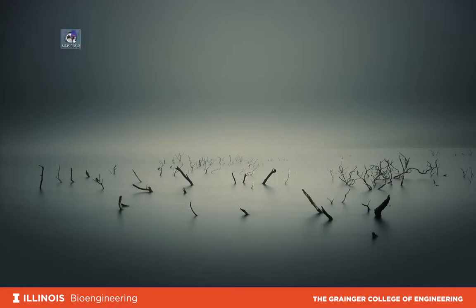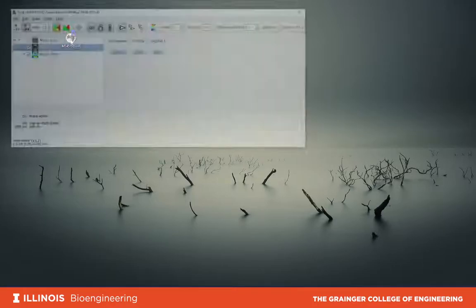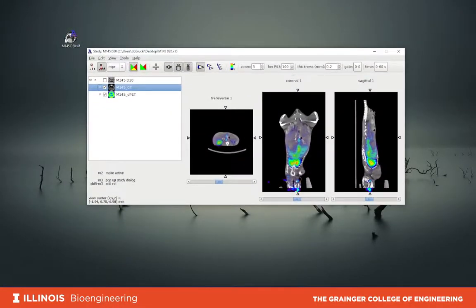This is one of the files being used for the homework. It's a dynamic dataset of nanoparticles injected into a mouse for the duration of 60 minutes. We reconstructed the images every minute, so we have 60 images at one-minute intervals. Let me open it up with a double click, and the MIT software opens up the dataset.